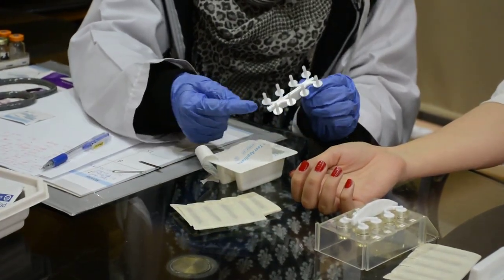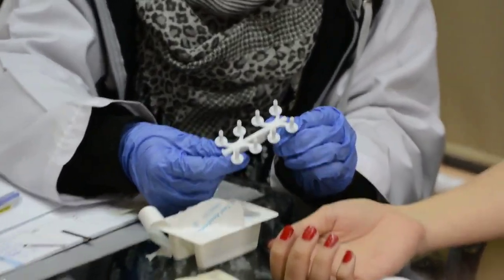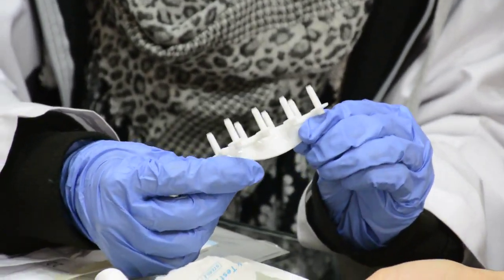But with these painless allergy test applicators, the allergy tests are done with high degree of sensitivity, specificity and low variability.